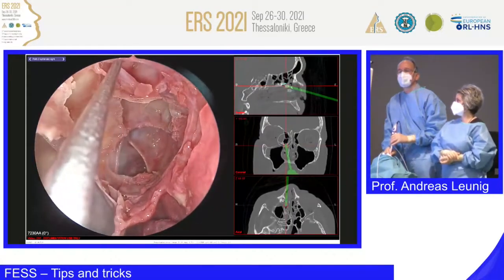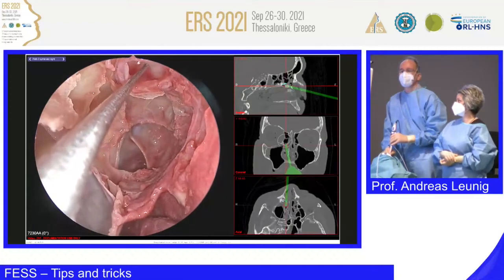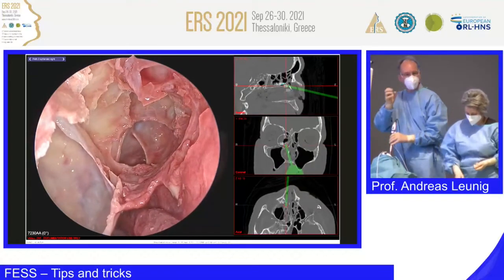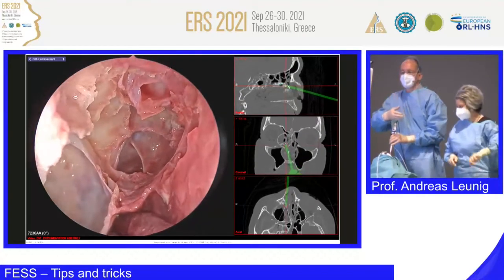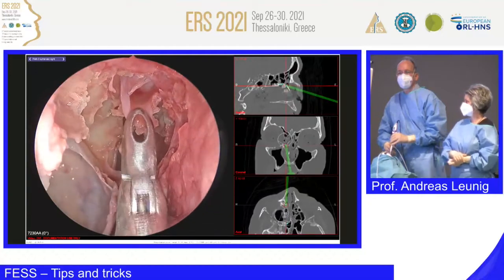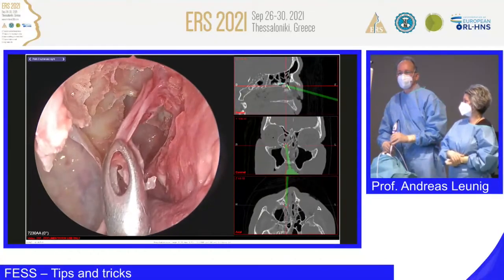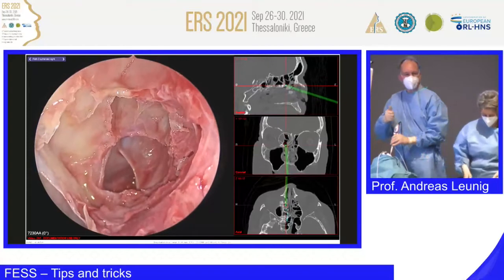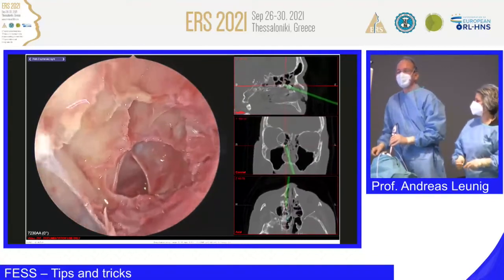So, okay, what do you think? Yes, yes, here. It's hard. It's hard, yeah? Okay. So, usually I would open it, I would marsupialize it, but now I take out the mucosa, okay, for demonstration's sake. Do it very gently. Okay, yes? Agree? We are safe. Thanks very much. Very good. You know, it's like tennis. You played me a ball and I got it back, okay? Thanks. Okay, thank you very much.